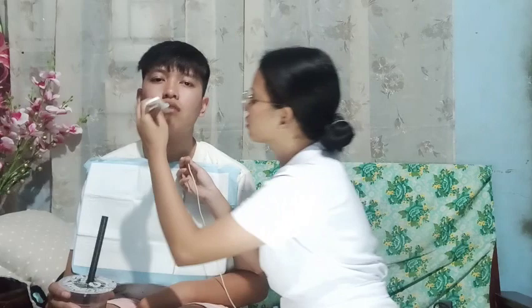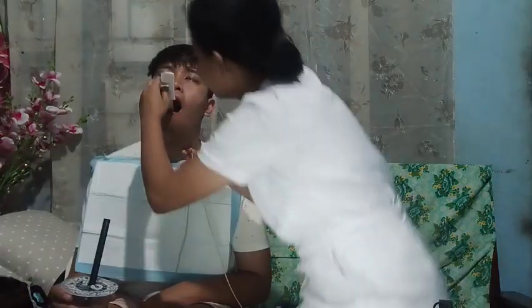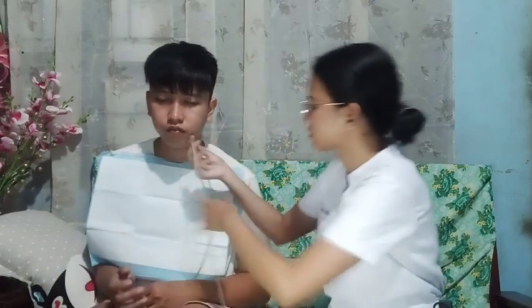Okay, open ko na yung. Okay. And then check the correct placement of the nasogastric tube by aspirating stomach contents. I will use this one to aspirate.